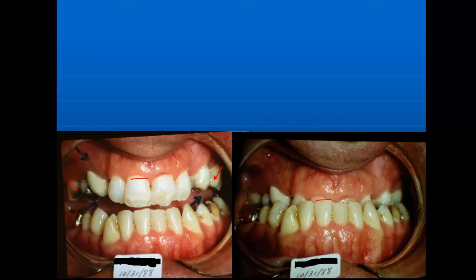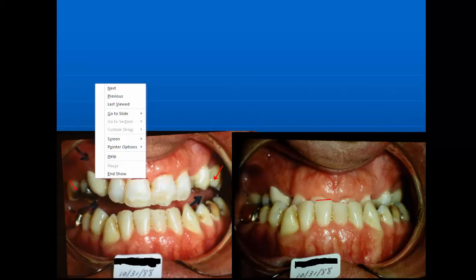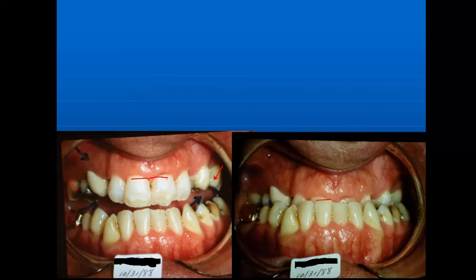Now he bites down and he rubs his upper front teeth on the lingual side of the lower front teeth and has actually ground them off, you see. And those teeth will be sharp right there where it goes in and slides down. Now, the lower teeth are going to come up to here somewhere. You can see over here now where we bite together, and the lower teeth are up to that point. And so the upper teeth would be down in here somewhere. When he closes, they're going to be down.